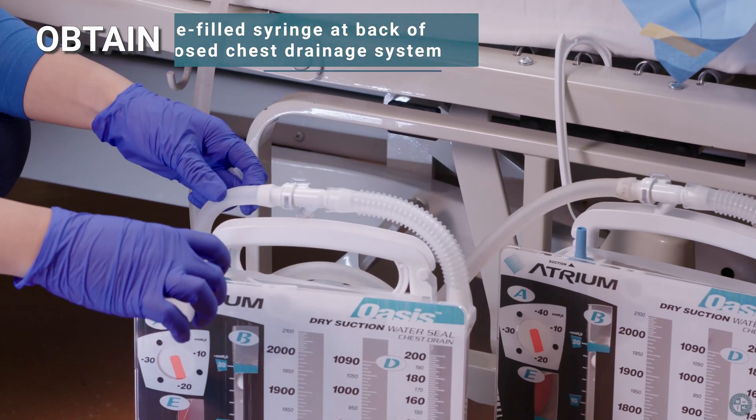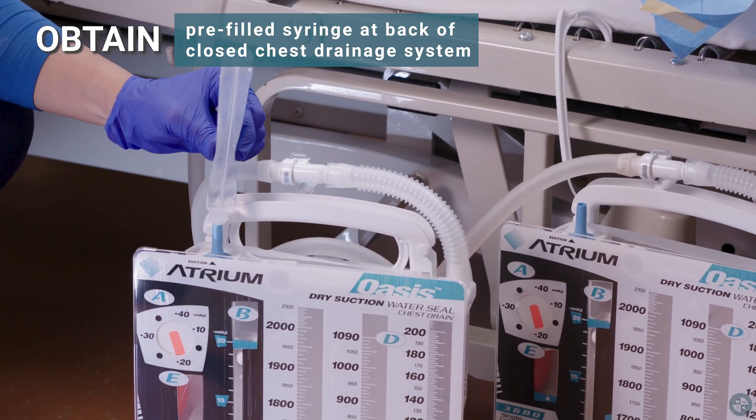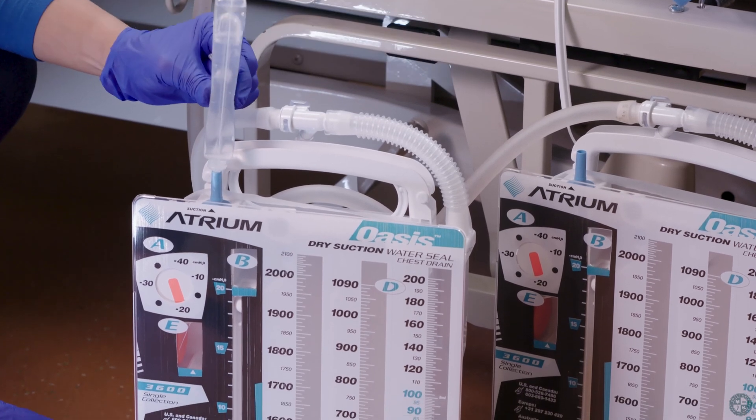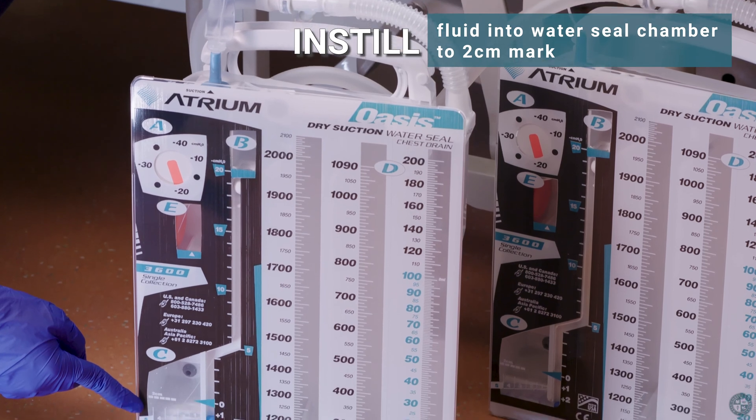Obtain pre-filled syringe, located at the back of the closed chest drainage system. Instill fluid into water seal chamber to two centimeter mark.